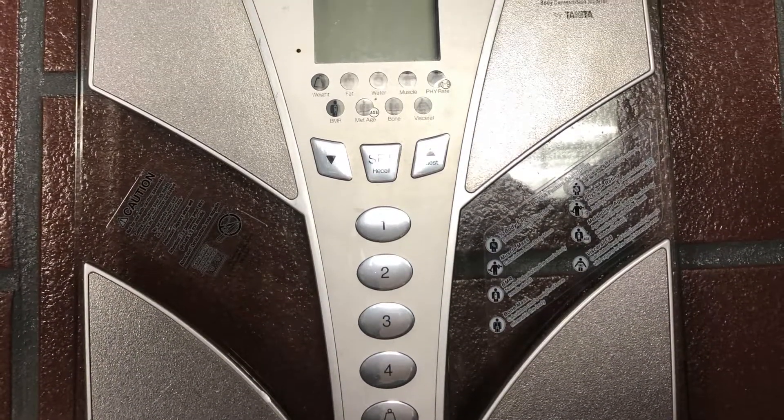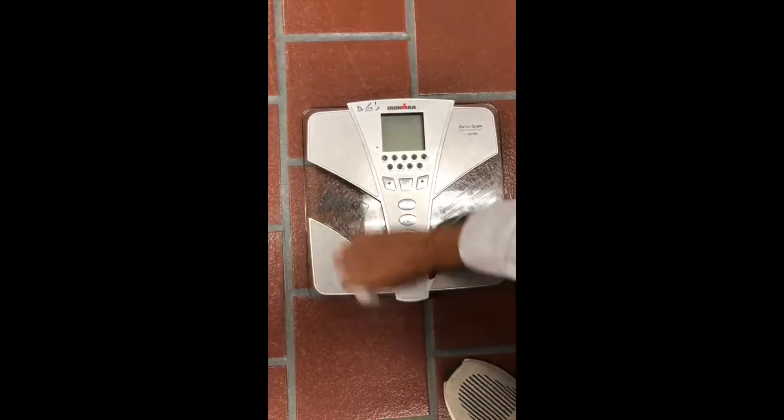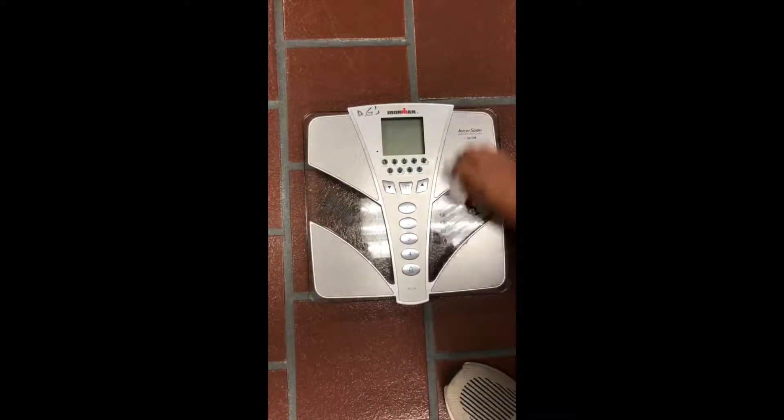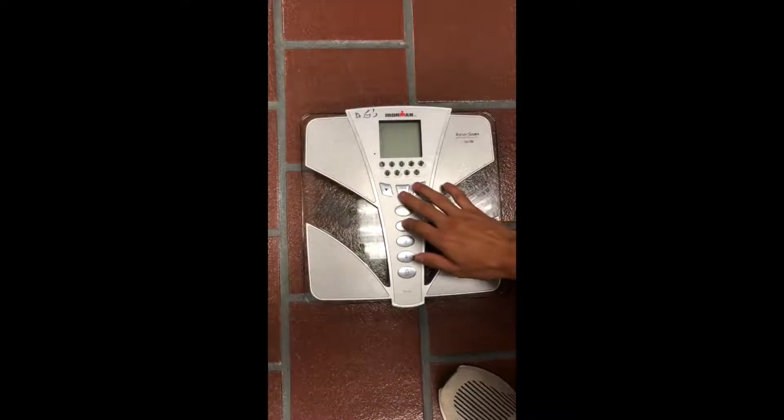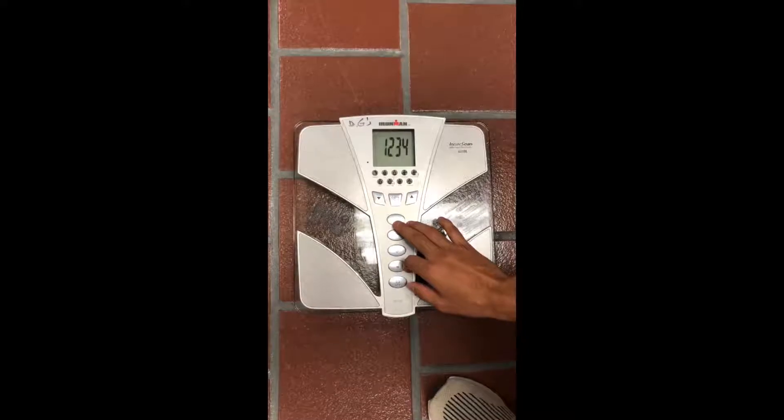In this video, body composition will be measured using an interscan body composition monitor. To begin, wipe down the scale to ensure it is clean. After cleaning, turn on the monitor and input the patient's age and height into the monitor.